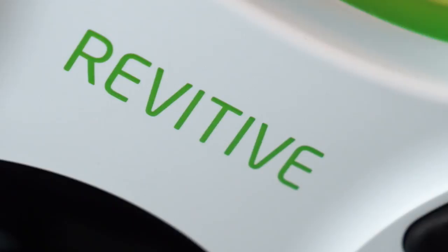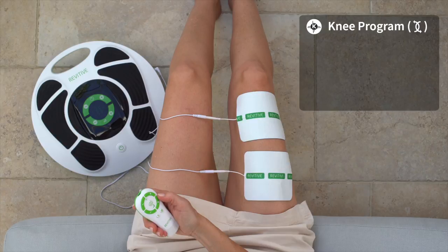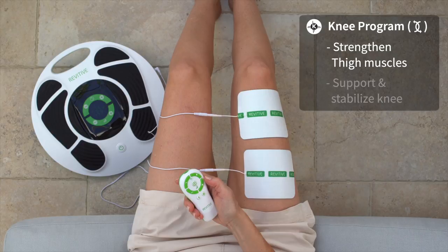Revitiv Medic Knee comes with large, reusable thigh electrode pads and a unique Knee Program to strengthen your thigh muscles, which may help to support and stabilize the knee.